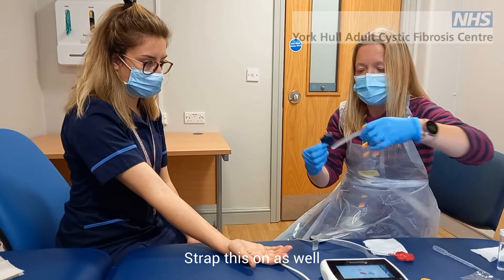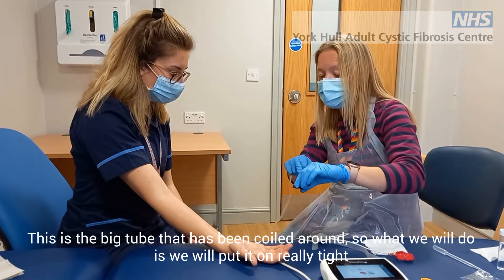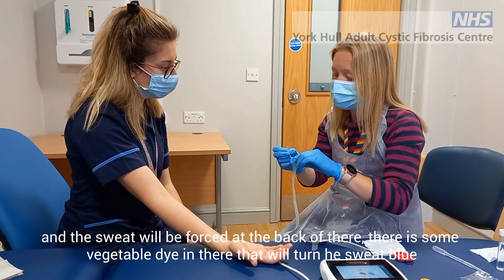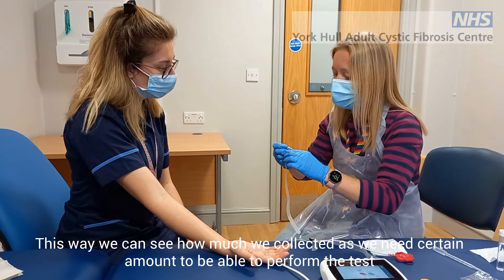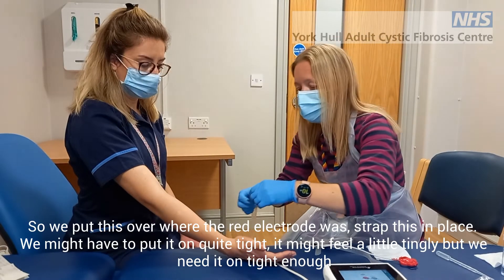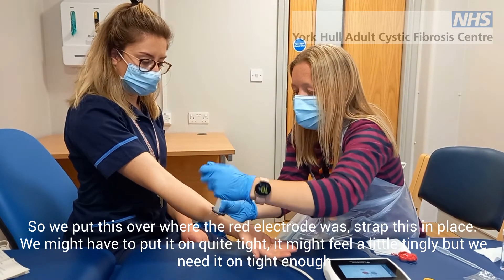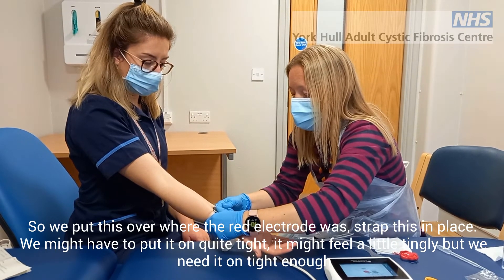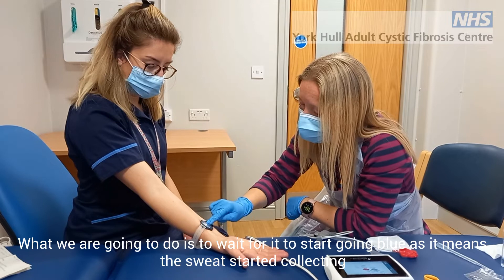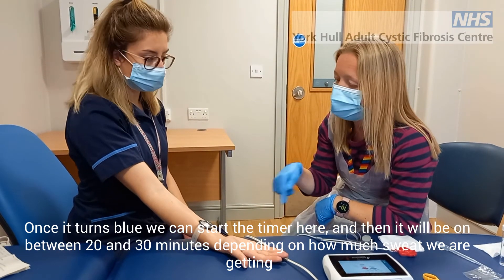Now we're going to put the collecting device on and strap this on as well. There's a hole in the back of this device and a big tube that's been coiled round. We'll put it on really tight and the sweat will be forced up into the back. There's some vegetable dye in there that will turn the sweat blue, just so that we can see how much we've collected, because we do need a certain amount. We'll place this over the top of where the red electrode was and strap it in place. It might be a little bit tingly, but we do need it on tight enough. We're going to wait for this to start going blue, because that means the sweat has started collecting. Once we see that it's blue, we can start our timer, and then it'll be on for between 20 and 30 minutes depending on how much sweat we're getting.